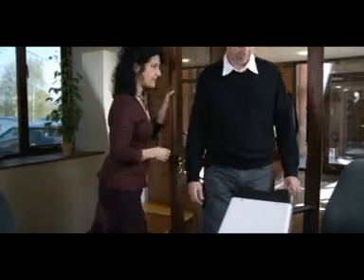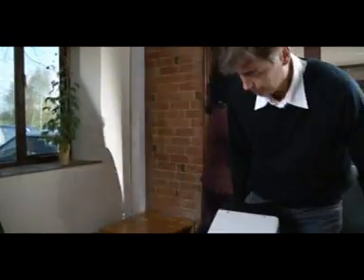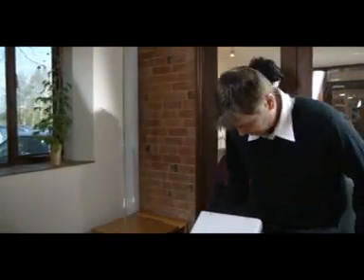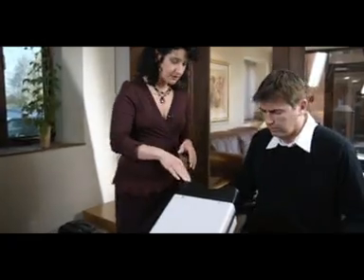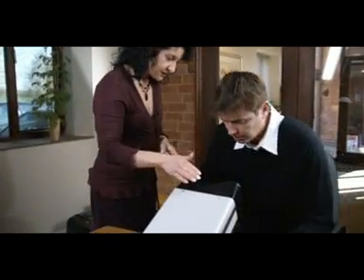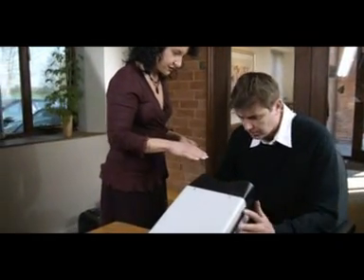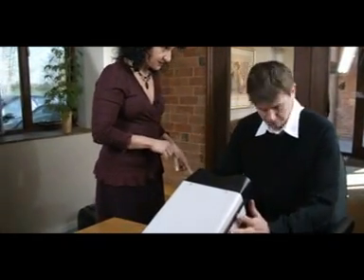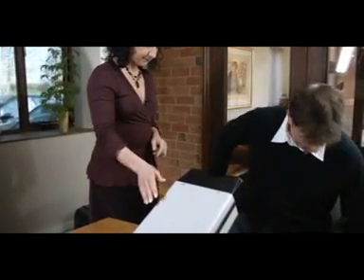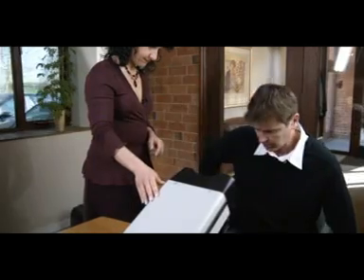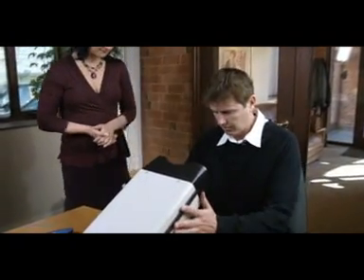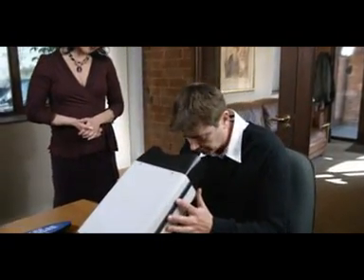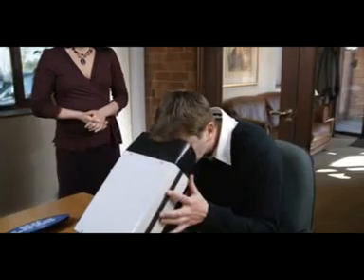When sitting down the person you're testing, you first need to ensure that they're sitting on a chair at a comfortable height to the table. The participant needs to be able to comfortably look straight down into the machine, so the viewfinder will need to be adjusted to the right angle.